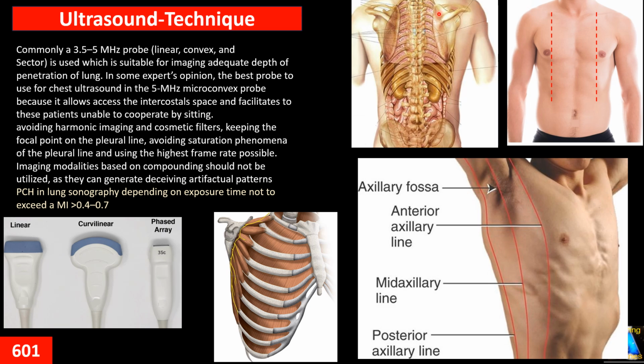For the posterior, we ask for the lateral surface and posterior. It's better for the patient in the lateral to hold his or her arm up, put it on their head, and for the posterior it's better the patient sits and wraps their arms around like hugging himself or herself, so that it expands and moves the scapula outside. We can have enough room for scanning the upper part and lower part.